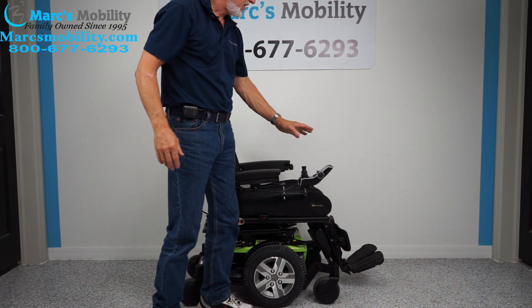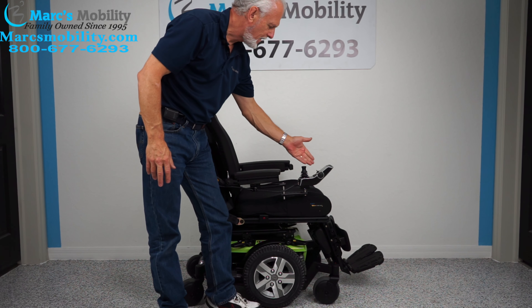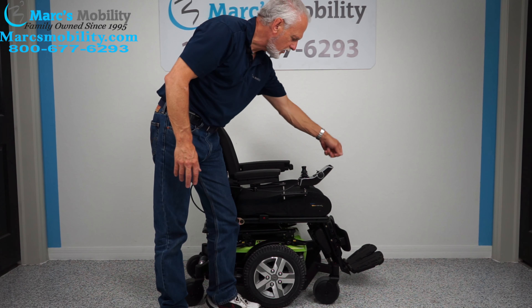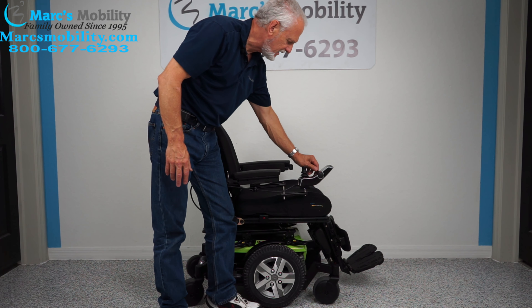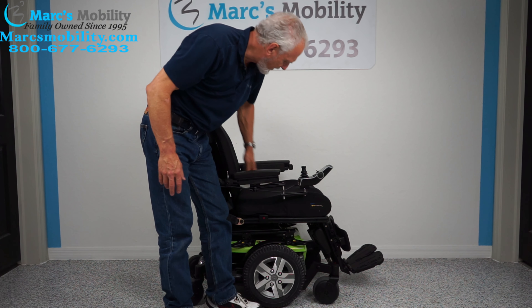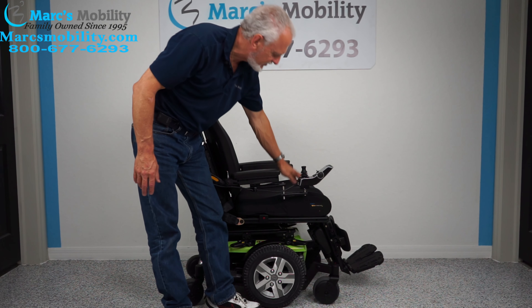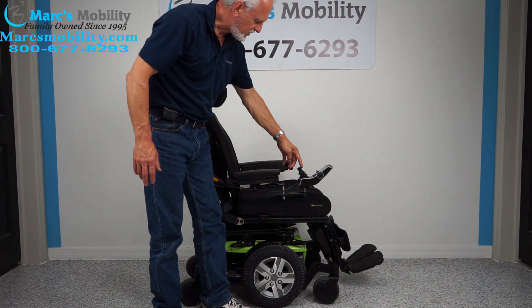All the electrical options you have to do through the joystick. What you do is take the button on the left and keep pushing it forward until you see a picture of the joystick, a picture of the seat. Keep pushing forward. When you see a picture of the seat, whatever is yellow on the seat — if it's the bottom and the back, that would be tilt. So right now the bottom is yellow, the back is yellow; I'm going to use my joystick and push it back.